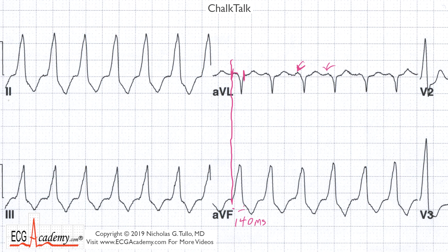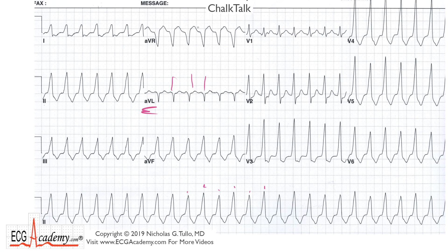You have to look at multiple leads. So what's the axis here? It's halfway between lead 1 and AVL — there's no true isoelectric. If it was isoelectric to lead 1 and positive in 2, 3, and F, that would give you an axis of +90. If it was isoelectric to AVL, that would give you +60. So the answer is in between — it's +75, which is normal. But it's wide and it kind of looks a little bit like a left bundle branch block in lead 1.